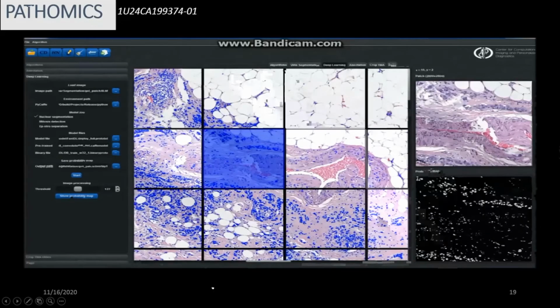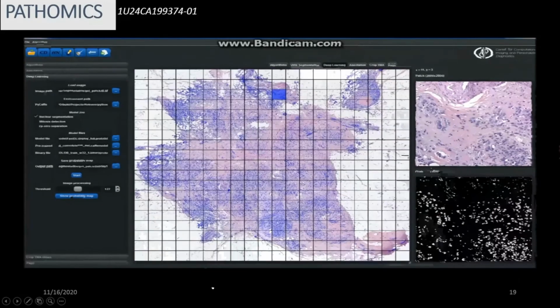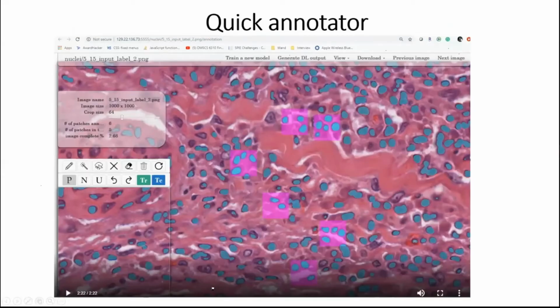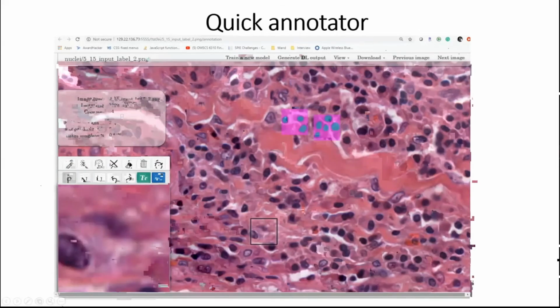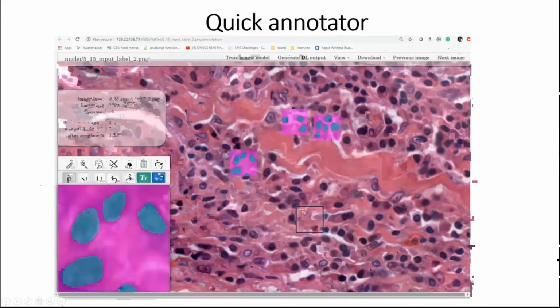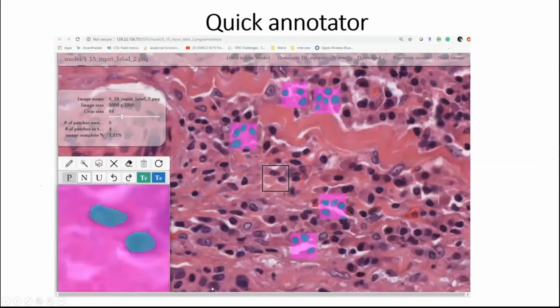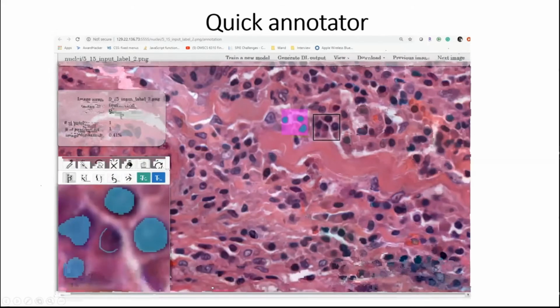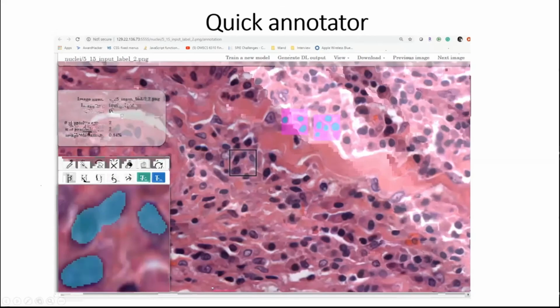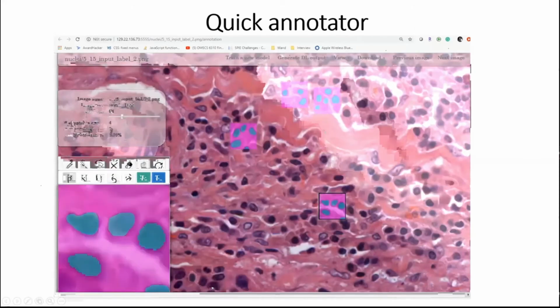And not only can they segment out these primitives very quickly and very efficiently, you can also train up your own networks in a pretty efficient fashion. This is work that's being developed in our group. There are other groups pursuing similar efforts, where you can stand up these deep learning networks pretty rapidly. One of the challenges hitherto has been that these neural networks are so data hungry, you're going to provide them hundreds, thousands of images which are deeply annotated. Well, who has the bandwidth to do all those annotations?